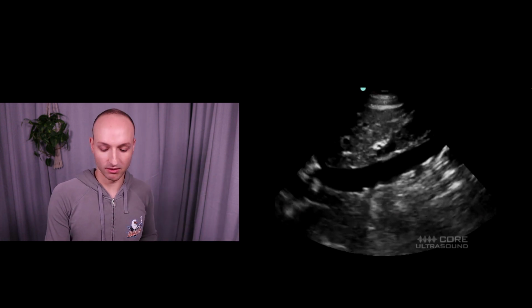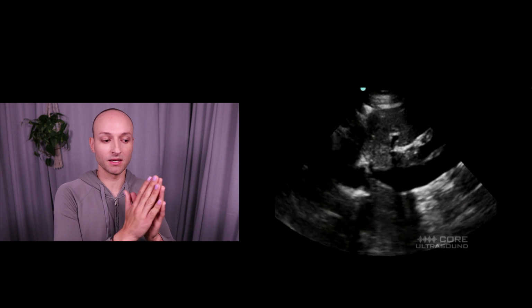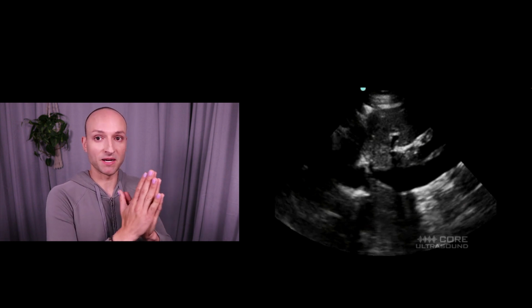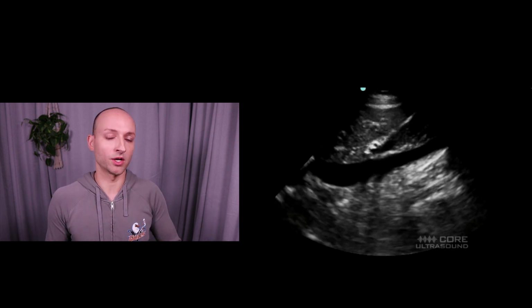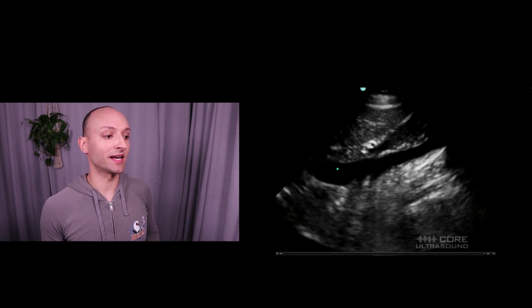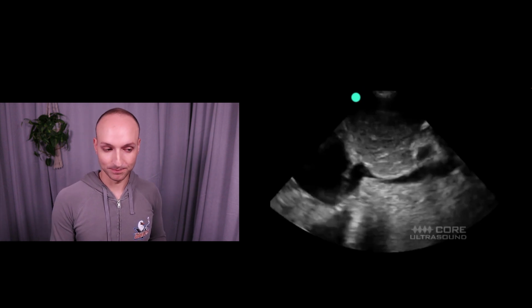So what I usually do is have the patient go through a few respiratory cycles, then hit freeze and cycle back on the machine, find the diameter as the patient took that big breath in, and then mark it about 2 centimeters from the right atrial junction, which would be about right here, and measure the diameter. Then have the patient breathe out, or cycle back on your machine until the diaphragm is the highest, and measure that exact same location on the IVC as your other diameter.